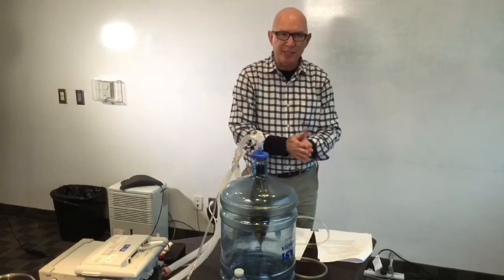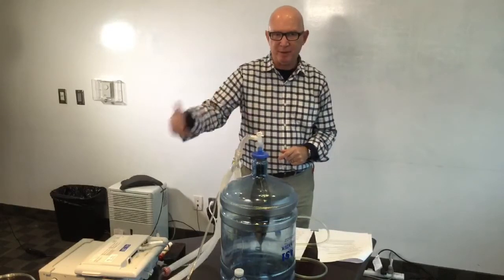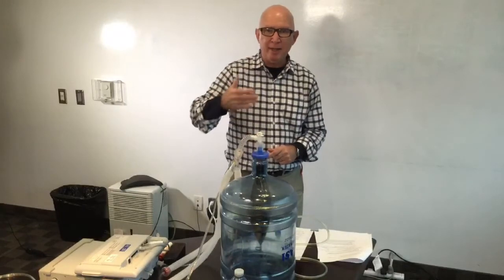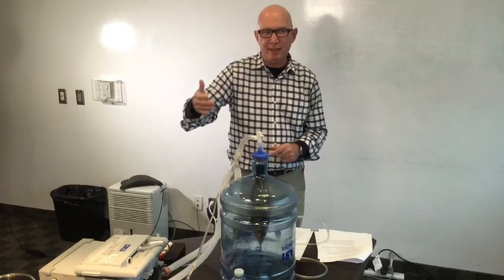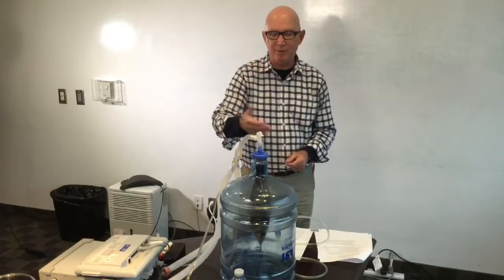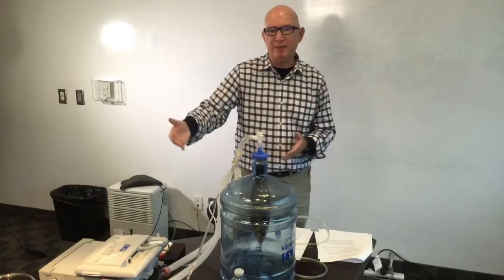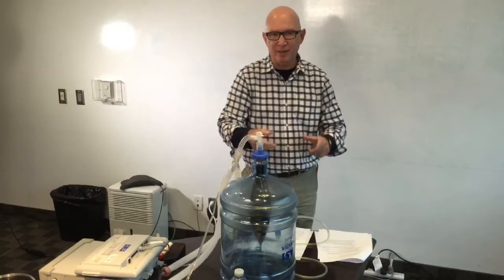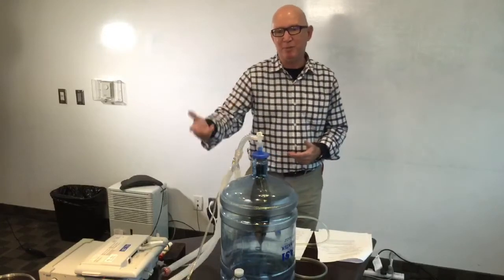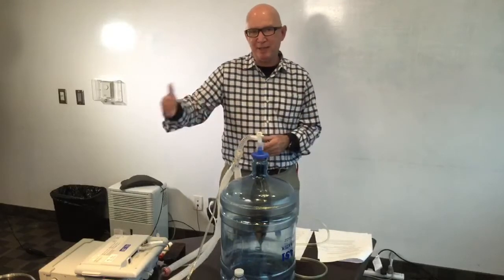When SIMV ventilation first came about, it was IMV back in the 70s, and at that time it wasn't synchronized with the mechanical breaths of the ventilator. So the ventilator was set up at 12 breaths per minute and the patient wanted 16. Those additional 4 breaths the patient got, they had to sneak them in somewhere between those 12 breaths per minute. And so you can appreciate already, without thinking about it a lot, that they could have a mechanical breath in their lung and now they want a spontaneous breath, or they've got a spontaneous breath in their lung and the machine says, well, time's up, it's my opportunity to give a breath. It gives a breath on top of the volume that already exists. So that type of ventilation, we didn't use for very long before it migrated into SIMV.